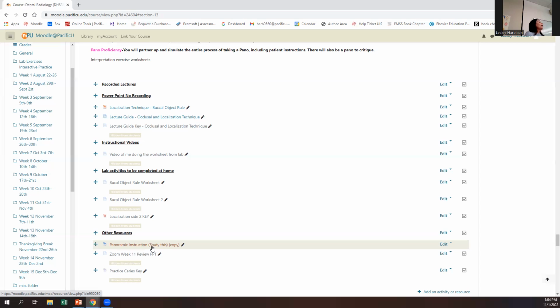This needs to be done without Teresa or myself, whoever's in there, but probably Teresa, prompting you. And then you'll give them the final instructions: tongue on the roof of the mouth, hold still, swallow, it goes around your head 15, 20 seconds. That whole spiel, you have to do all of that without prompting.